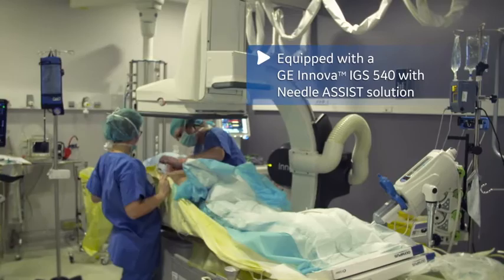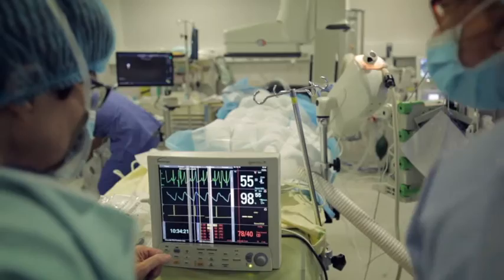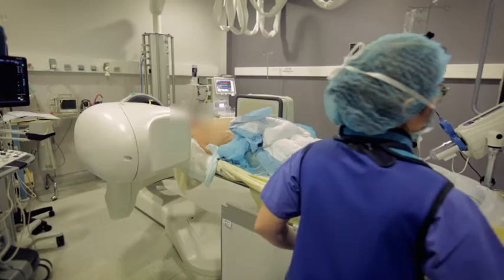We are equipped with the GE Inova IGS 540 interventional x-ray system with the needle assist solutions, and we also have a Logic E9 ultrasound platform with the XD-Clear 2.0.